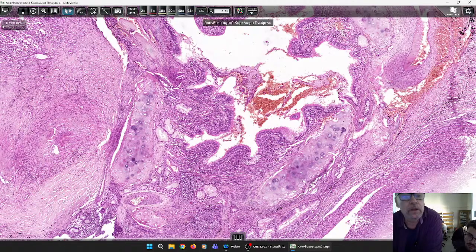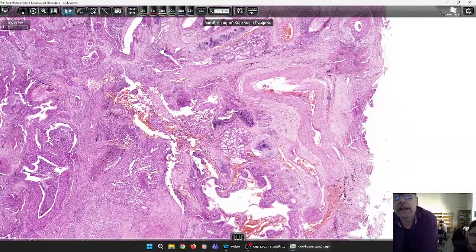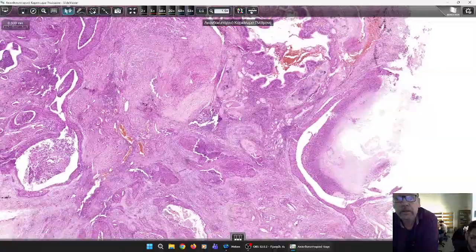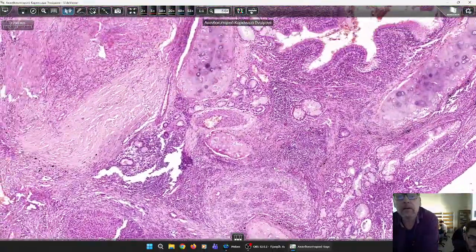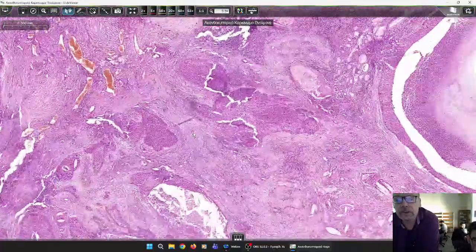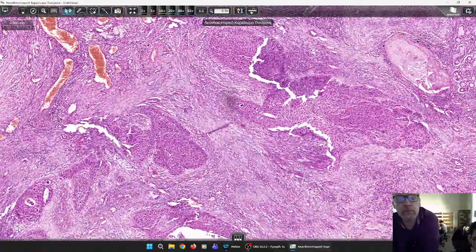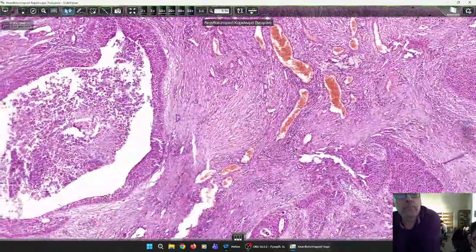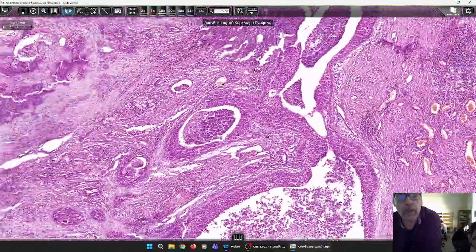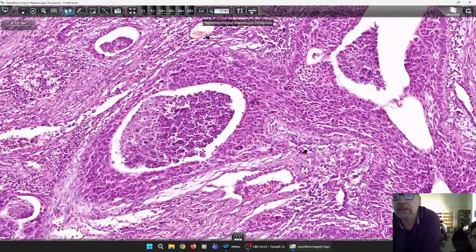This is a bronchus. Yes, but we must have a look if there is some sort of metaplasia of the columnar epithelium and dysplasia. Let me have a look. Because in other parts, you see these foreign structures. You see these islands of dark staining tissue, and you see in the middle some formations from these atypical cells. You see? What can this be?